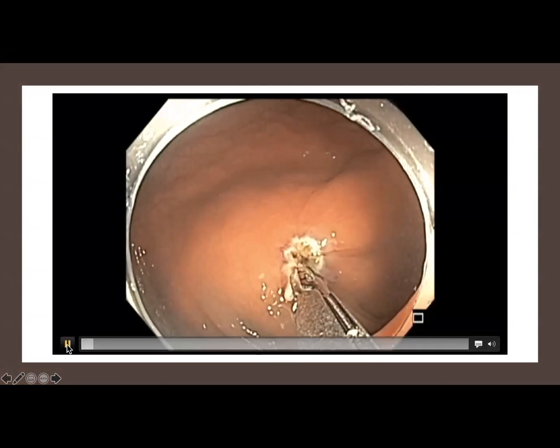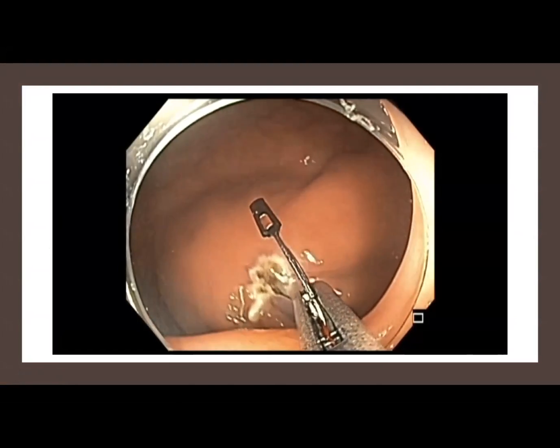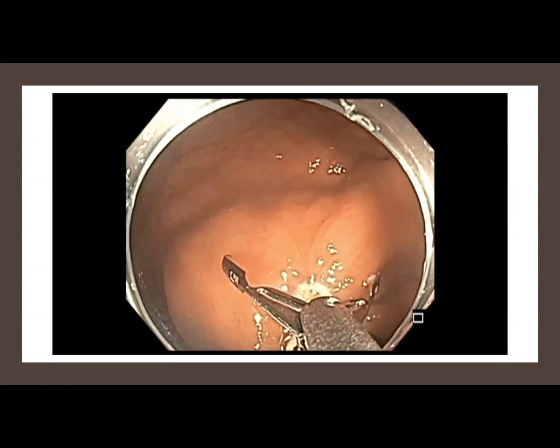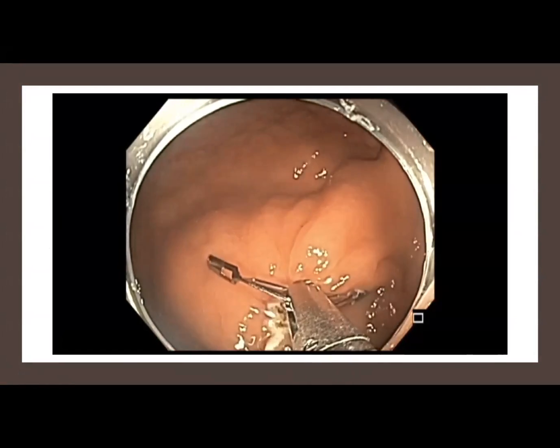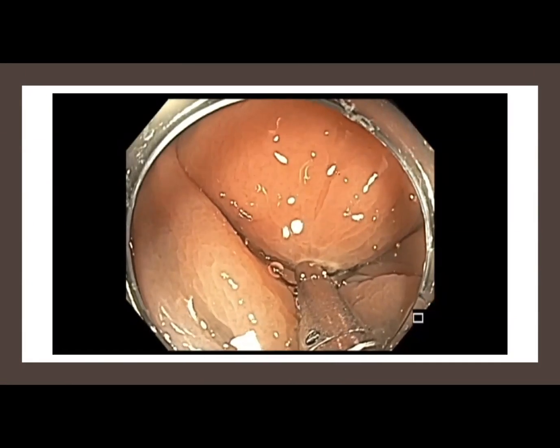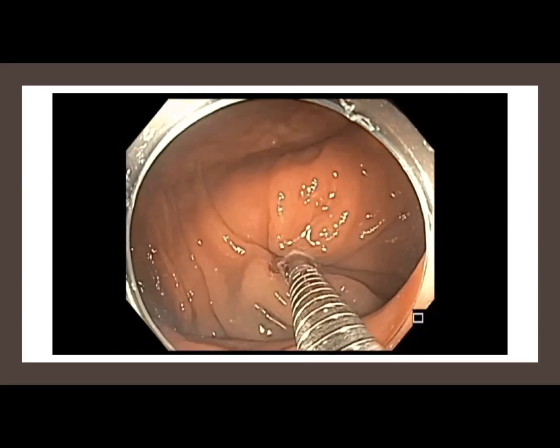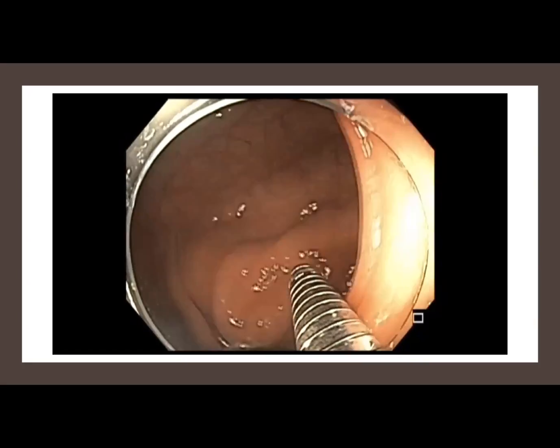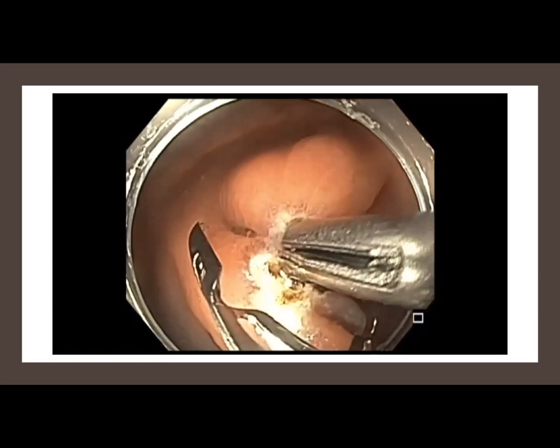All right. So we decided to clip it. And actually, this is a very long clip. So as you can see here, when you apply the clip, you want to make sure that your two blades are deep and you don't have any space between the two blades. So that is very important to keep in mind.